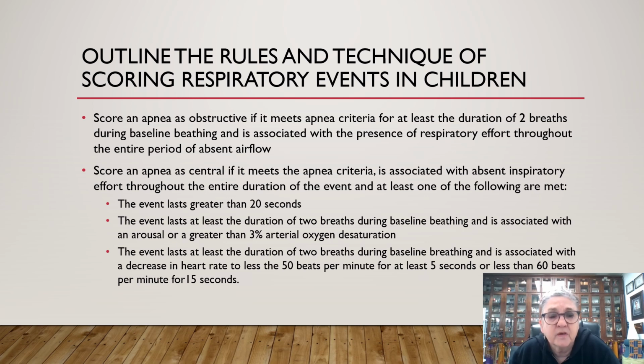The event lasts greater than 20 seconds. The event lasts the duration of 2 breaths during baseline breathing and is associated with an arousal or greater than 3% arterial oxygen desaturation. The event lasts at least the duration of 2 breaths during baseline breathing and is associated with a decrease in heart rate to less than 50 beats per minute for at least 5 seconds, or less than 60 beats per minute for at least 15 seconds.